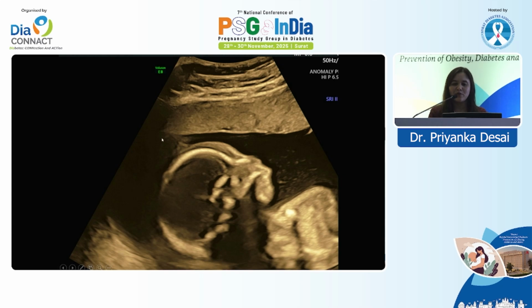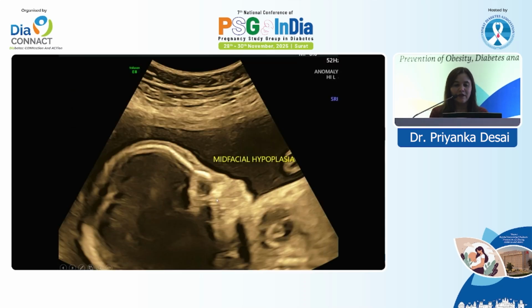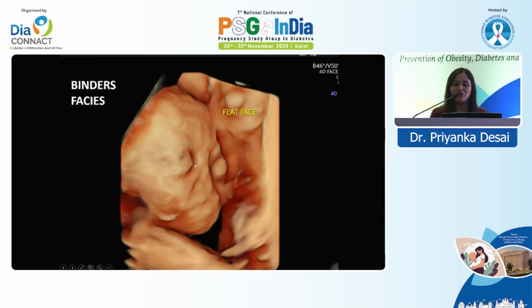So my next case is a 22-weeker. Again, we can see type 2 diabetic and there is a receding chin. So this was a case of micrognathia. This is a 3D image where the micrognathia is clearly evident. So another patient, 22-weeker, again a type 2 diabetic, IVF conception. Here this is a facial profile, we can make out a grossly abnormal face with mid-facial hypoplasia. And this is a 3D image of the fetus. This is called a flat face or Binder's face, which is very commonly seen in diabetic mothers.